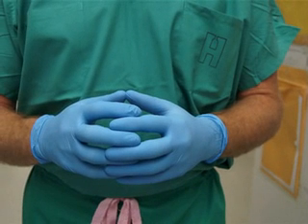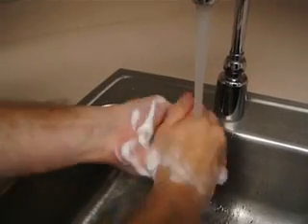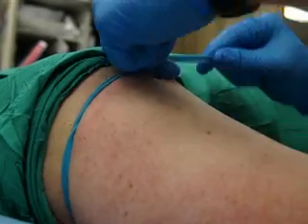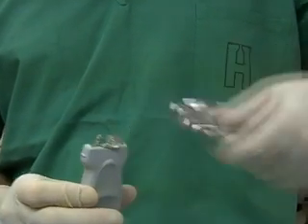Placing a peripheral IV does not require the operator to wear sterile gloves and a gown. However, hand washing, clean gloves, and universal precautions are indicated. Clean the ultrasound transducer thoroughly with a germicidal solution. Apply the tourniquet. Apply gel or surgical lubricant.